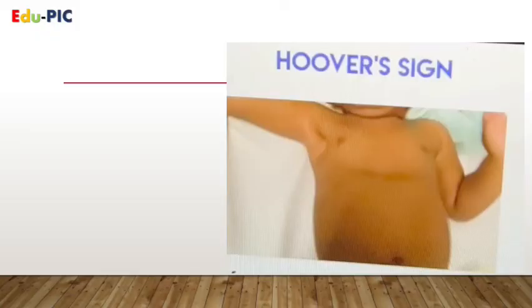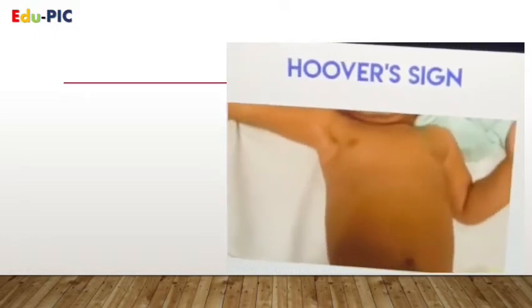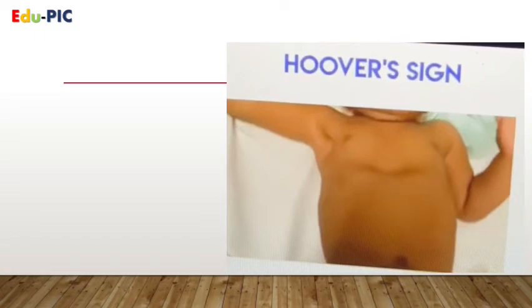This is the Hoover sign. You can see the paradoxical movement of the chest wall and abdomen.